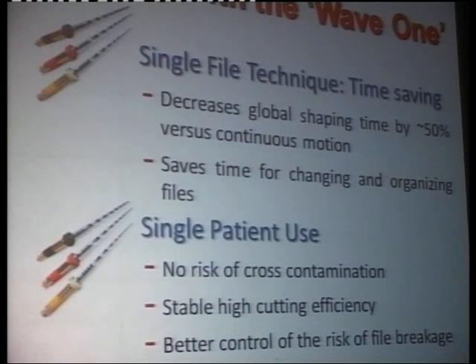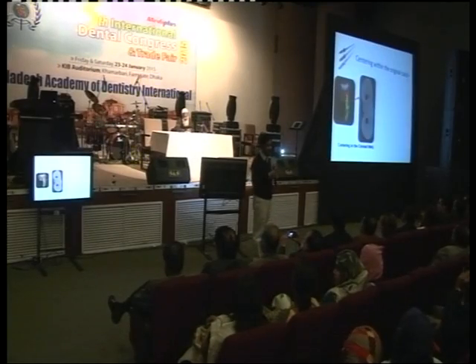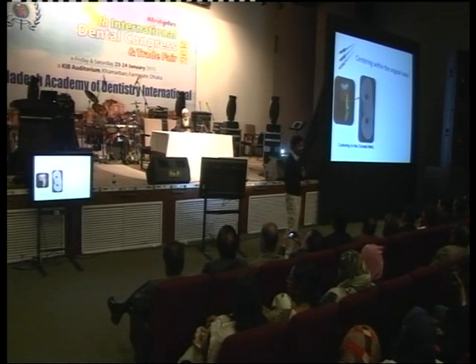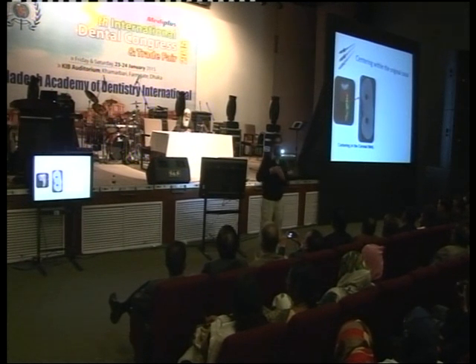You cannot reuse it because it's single use, so we are saving time. Another benefit is that it always maintains the center of the root canal system. One of the objectives is to maintain the original shape and centering of the canal. It is very important, and they are claiming that this file maintains the center of the canal. Yes, it maintains it.